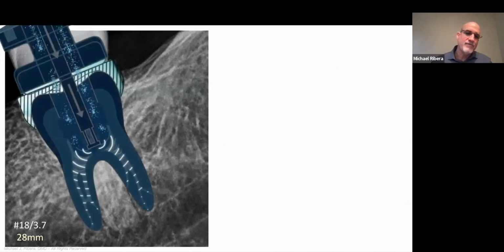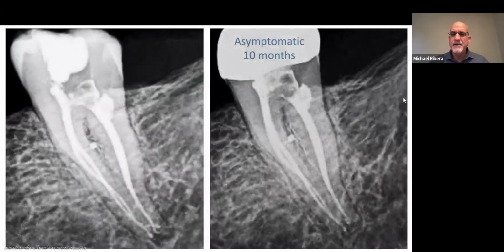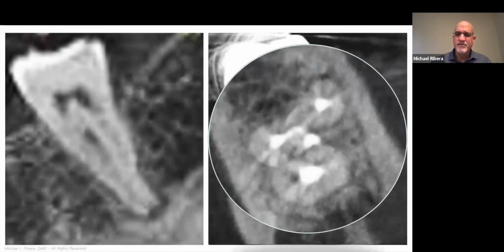So we basically run GentleWave. This is the original molar PI instrument. We run 8 minutes. This is the pack. Well, we've got maybe an anastomosing branch right here, maybe bifidity, a focal canal at the top. Well, that's what shows up. 10 months down the line, this patient comes in fully asymptomatic. And these are your cone beam images right here.